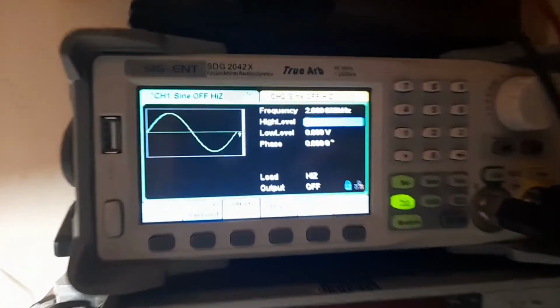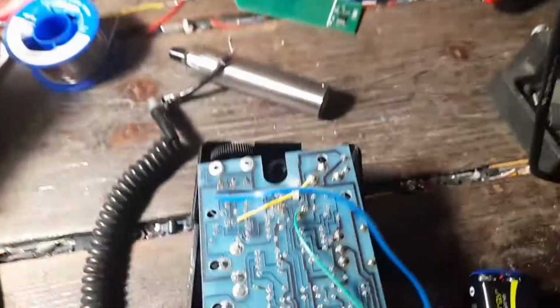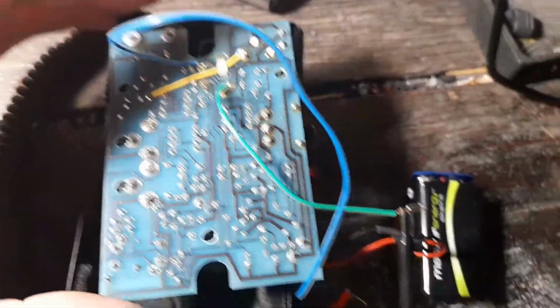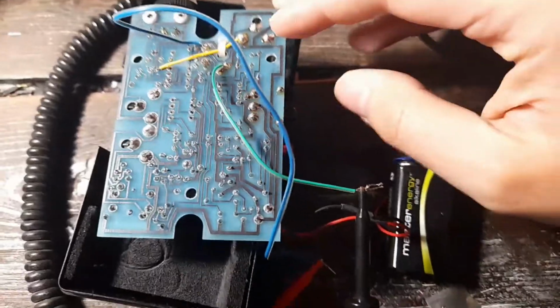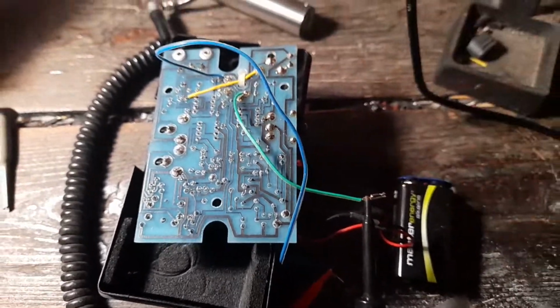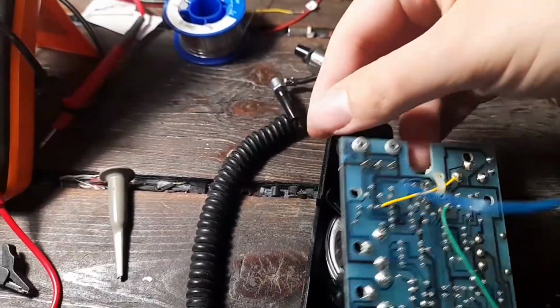Then I just adjust the function generator to produce a sound signal at very low settings, because I don't want to destroy the amplifier. And let's test the speaker. I just turn it on, and so the speaker unit seems okay.